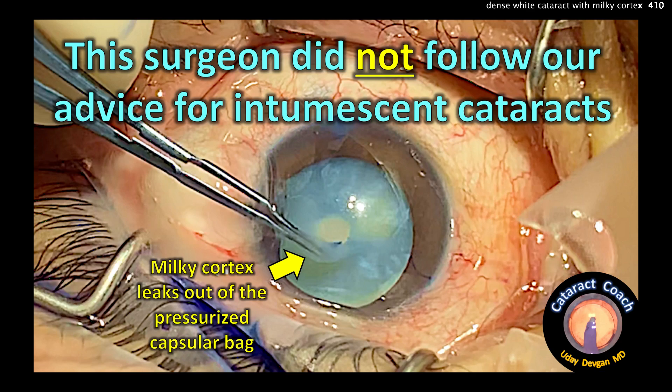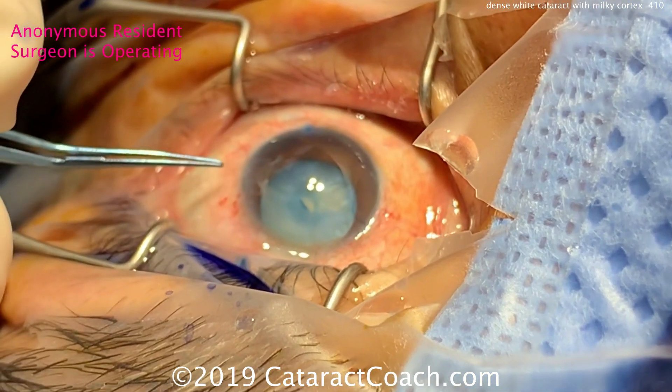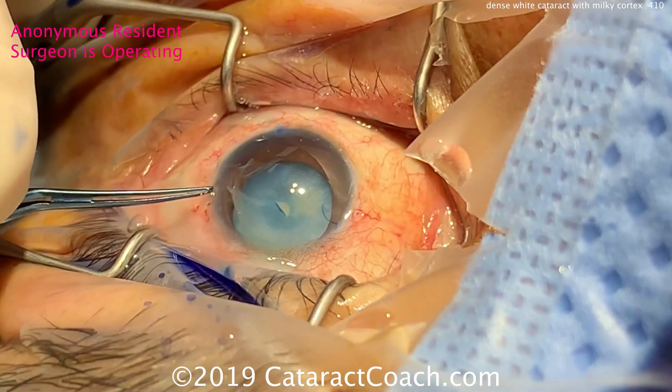CataractCoach.com. This surgeon did not follow our advice for intumescent cataracts, and we see the milky cortex leaking out of the pressurized capsular bag.